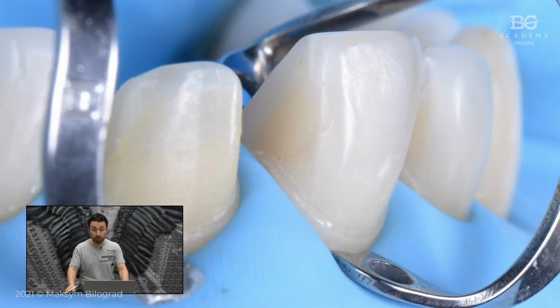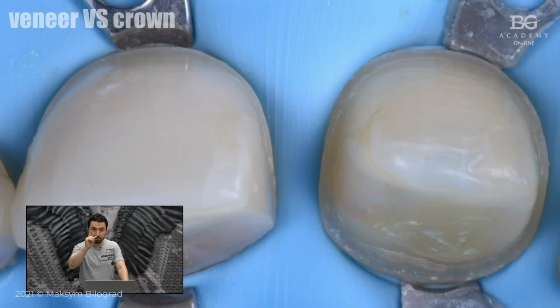Isolation. You can see veneer and crown here, just to compare. This is important information. When you do crowns like Emax, for example, or lithium disilicate crowns, from the palatal side the minimum thickness for the crown should be about 0.7 to 1 millimeter, because of function.